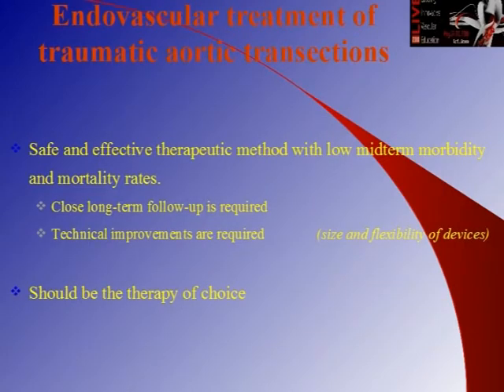Endovascular treatment of traumatic aortic transections is a safe and effective therapeutic method with low morbidity and mortality. It requires long-term follow-up, and more technical improvements of stent grafts are required. It should be the therapy of choice.